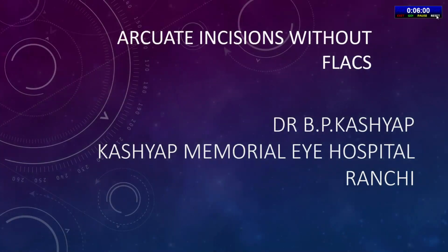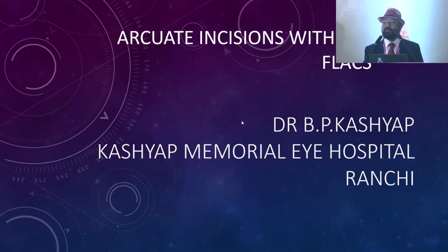Nowadays, if the astigmatism is more than, let's say, 1, I go for toric lenses. But many times, when the toricity is not very high and you're going for simple monofocal lenses, there is some amount of residual toricity. What do you do? And even if you are going for toric lenses, there's some amount of residual toricity. What do you do? Then probably the answer is LRI or Arcuate incision.